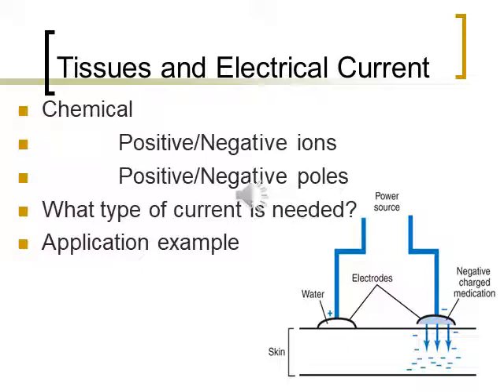The other electrode is going to be used as what's called a dispersive pad, okay, so you still need both to complete the charge. Otherwise, you're not going to have a current that can be delivered if you don't have both terminals on. In the case of what we're showing here, it's basically just a dispersive pad. Sometimes with the dispersive pad, you just stick it on the skin. Other times you use just a regular agent such as water. But that serves as your dispersive electrode.